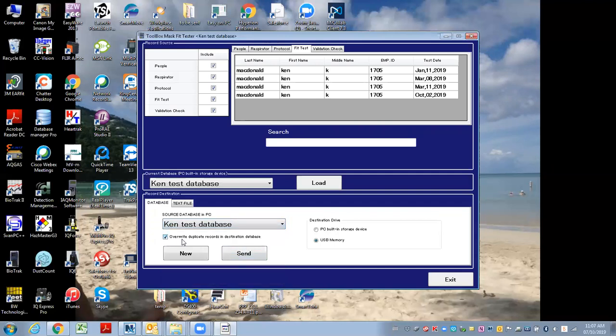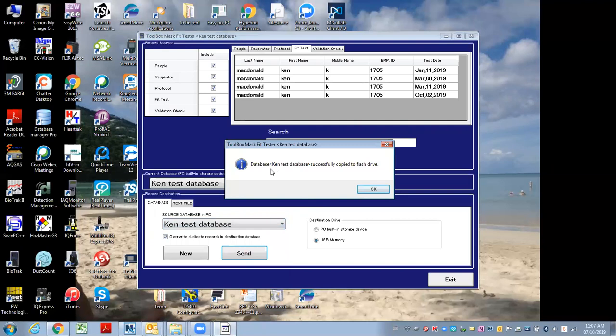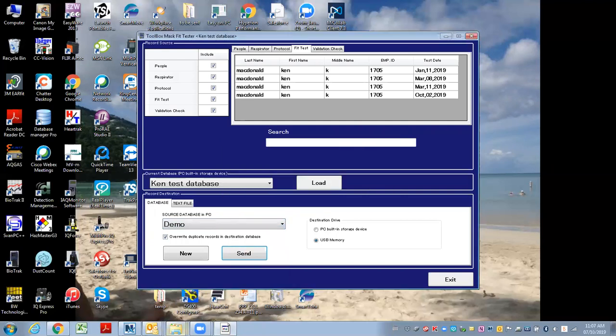I'll hit overwrite duplicate as well, because you may be sending data out and importing on a regular basis. So I hit send, and it says it successfully copied to the flash drive. Let me go over and look at the flash drive.